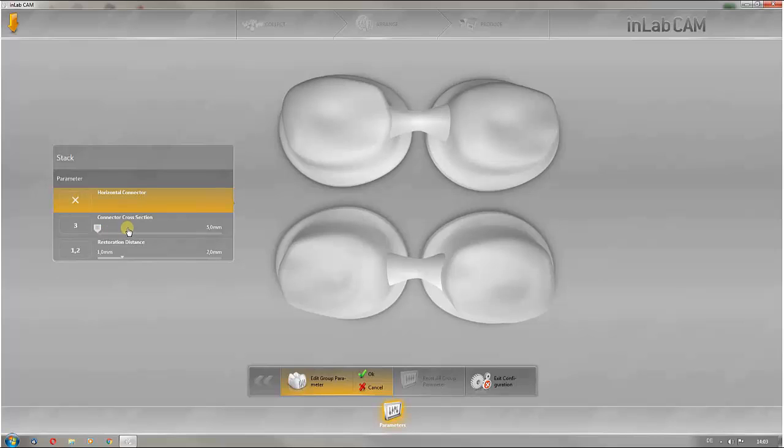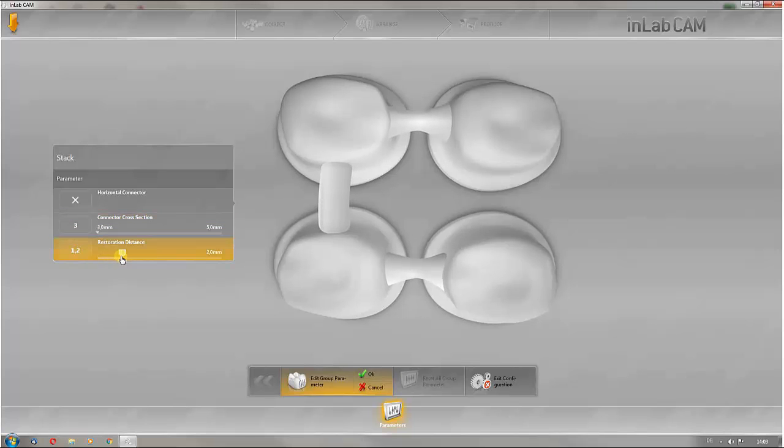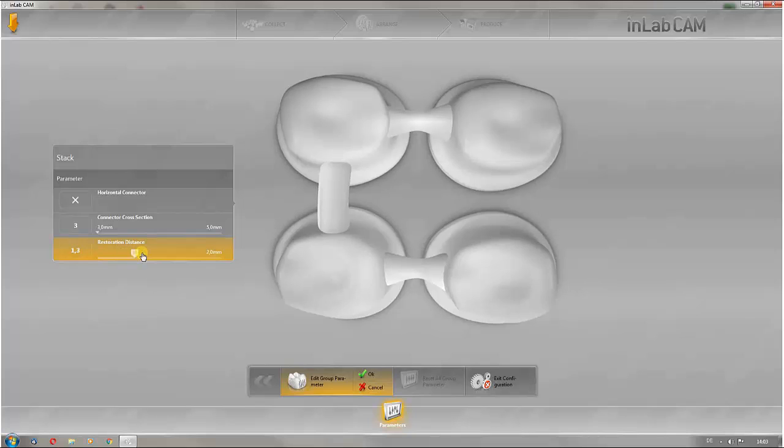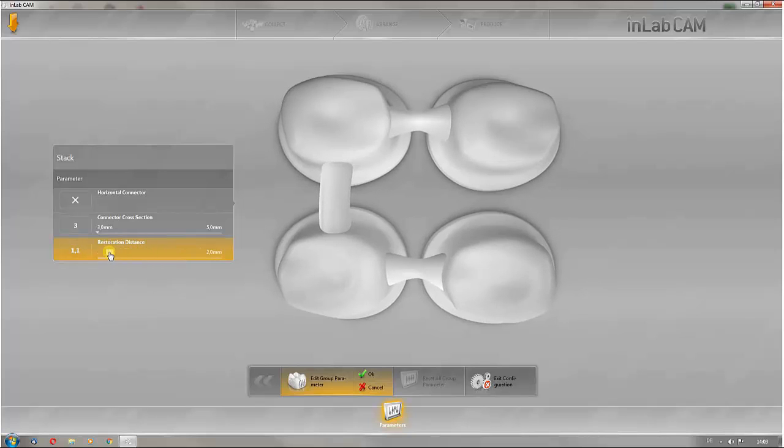In addition, the thickness of the connectors and the distance between the individual restorations can be predefined. Usually, the preset parameters in the software already achieve satisfactory results and do not have to be changed.